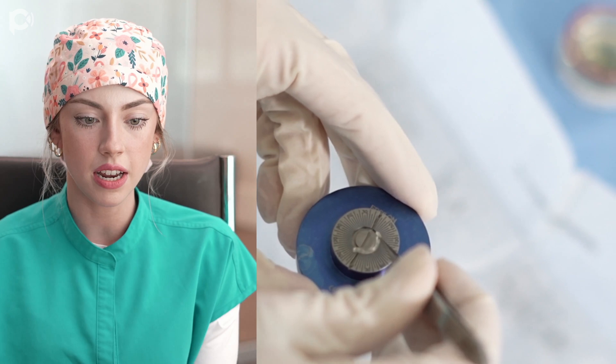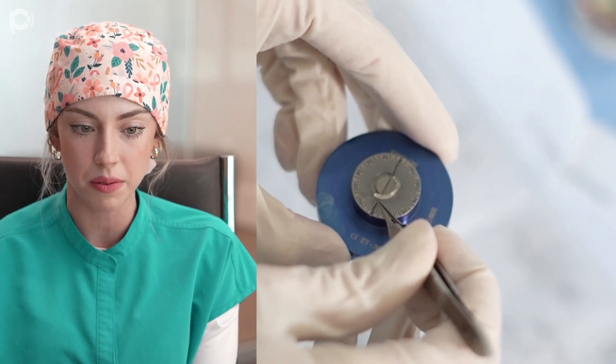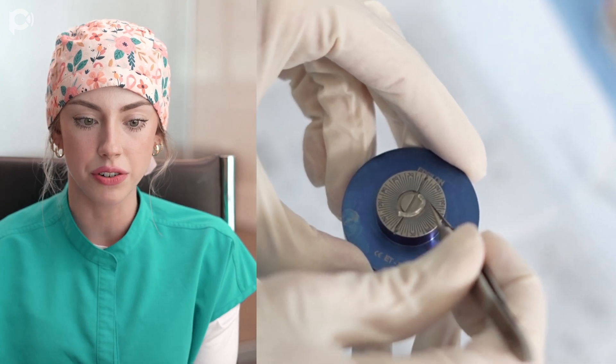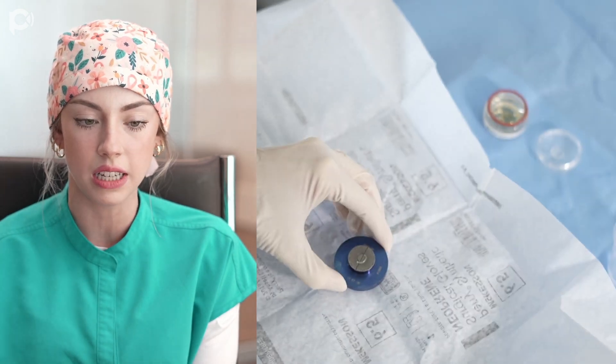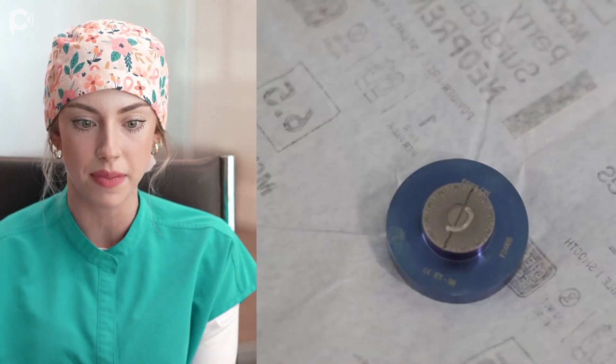Then once I've gotten it as dry as I can, I'm going to lay it onto the CARES drying device that we have. It has these nice little grooves in it that hold the segment in place so that it's able to dry in the shape that we want.